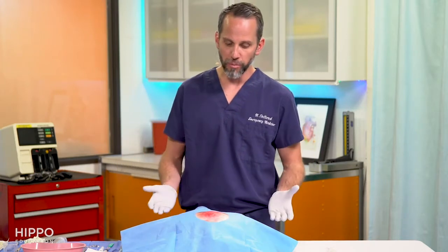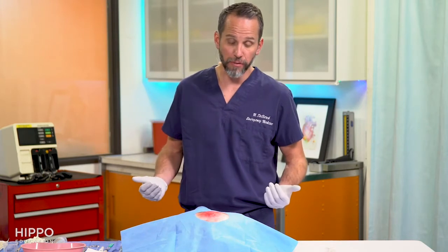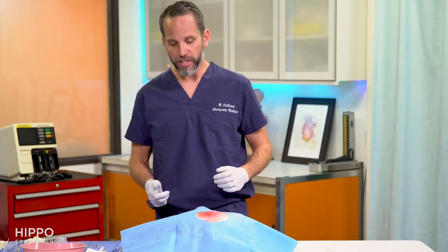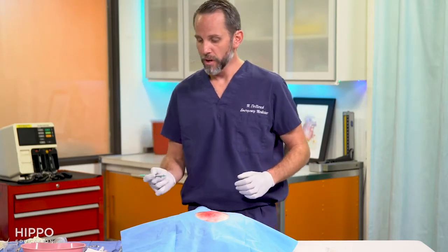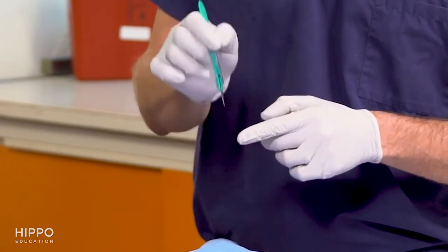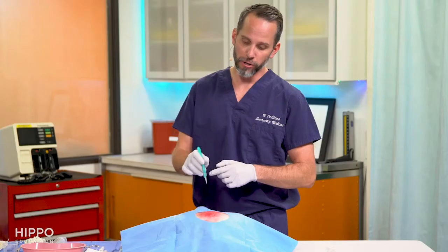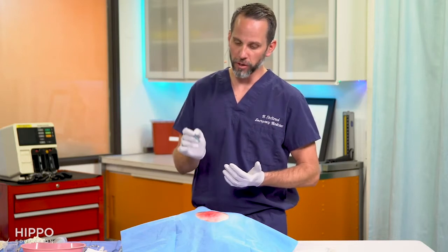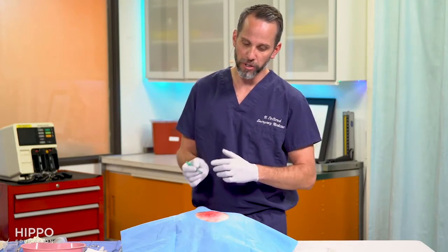So now your patient is properly anesthetized. It's time for making the I part of the I&D, the incision. When you're making your incision, there are two things you want to remember. The first is make sure you're using an 11 blade because it's a nice long sharp blade that you can puncture with and make that cut. The other surgical blades will work, but they're a little bit harder to use with a curved blade. So one that has a nice puncture part is going to be useful.